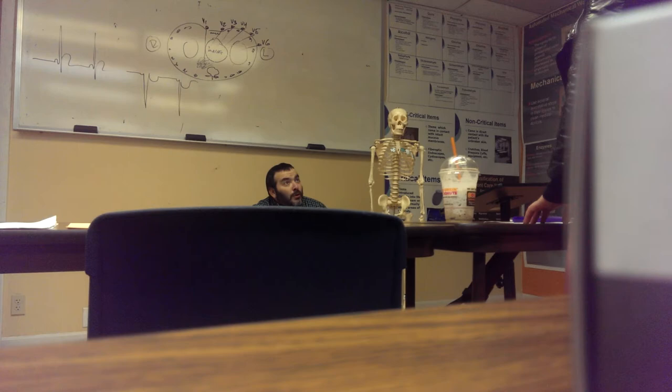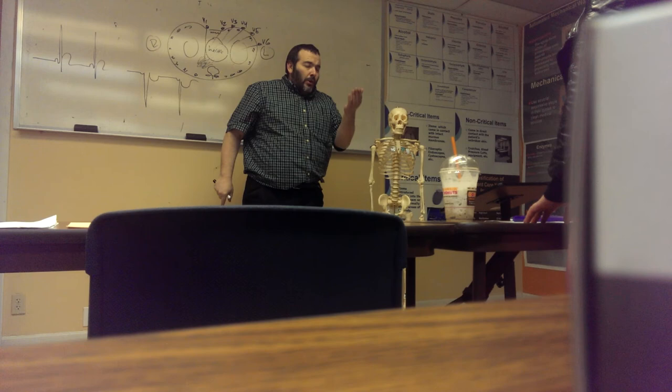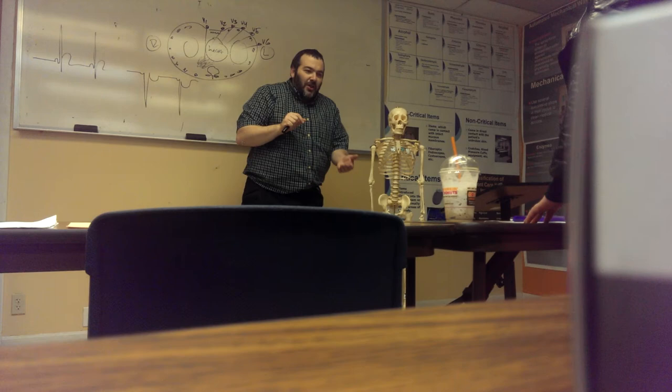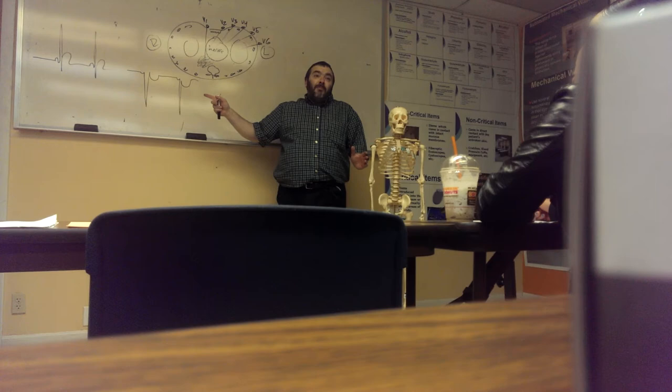Because I'm looking up. But if I were to climb up on the table and look down at you, would you look taller or shorter to me? Shorter. And if I were to climb up on the roof and look at you, it would look like an ant. The higher I go, the smaller you look. The lower I go, you'd look like a giant. Have a seat. So same thing here. Wherever I place my points of view, my electrical impulses from that direction will look different.